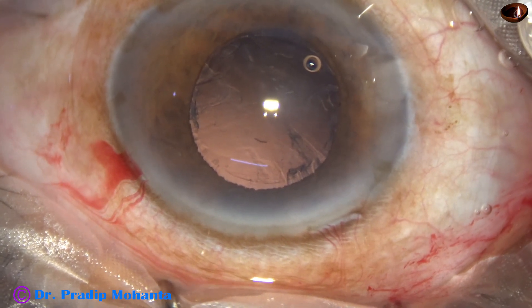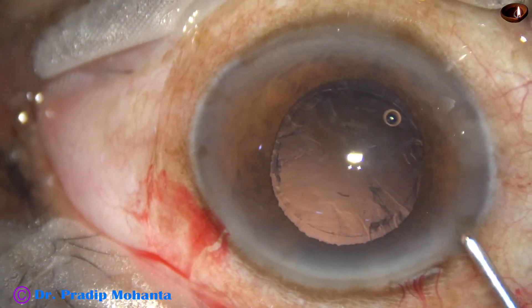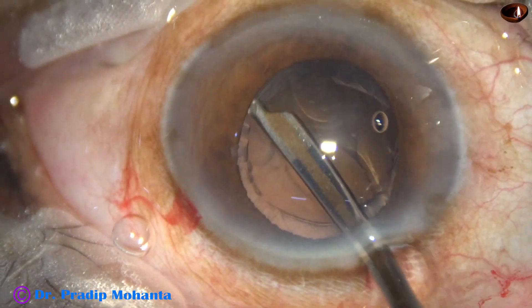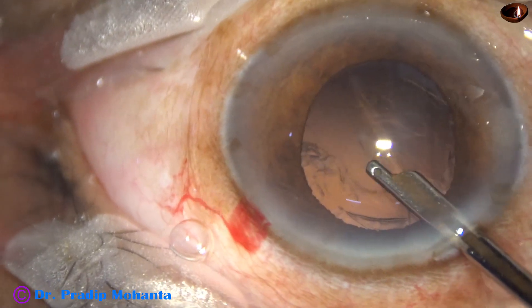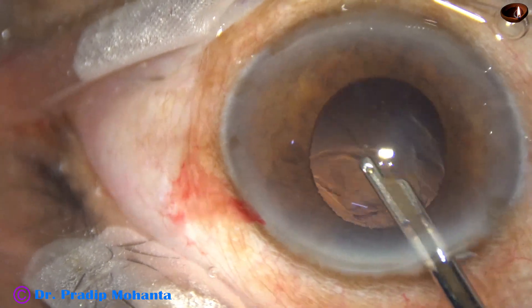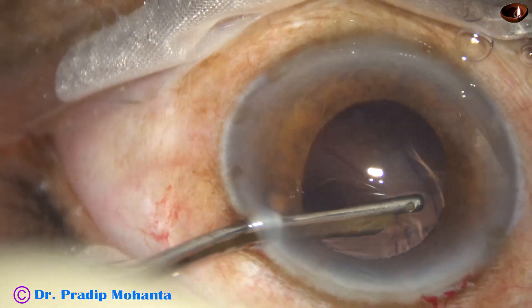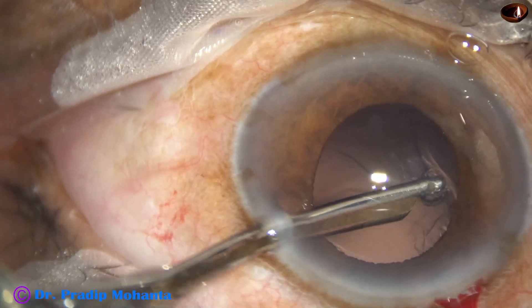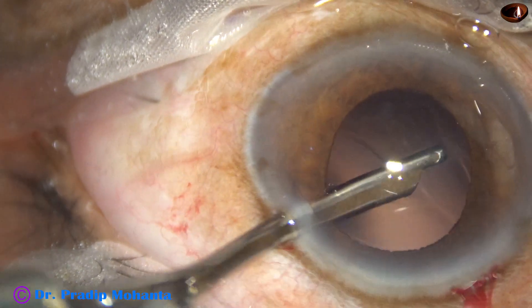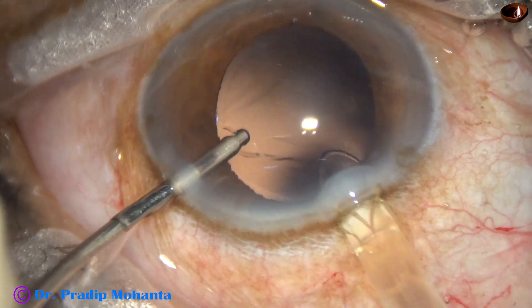Now, cortical clean-up will be done. With the help of a Simcoe cannula, the cortex is being removed. Sub-incisional cortex is removed going through the side port. The width of the side port is 1.6 millimeters and the Simcoe used is 23 gauge.